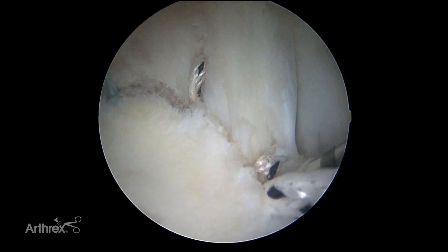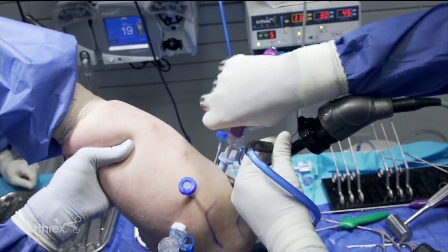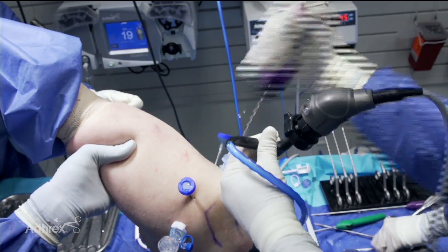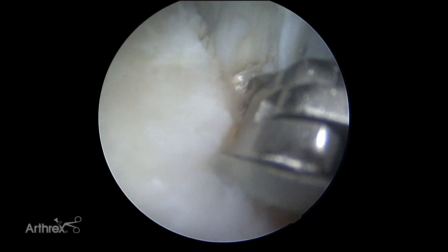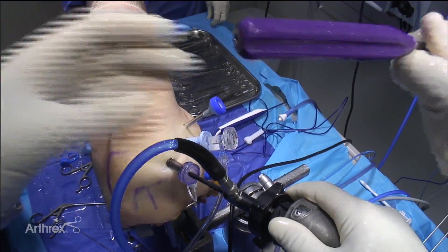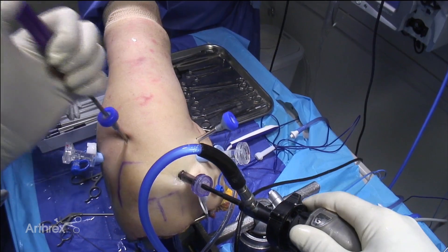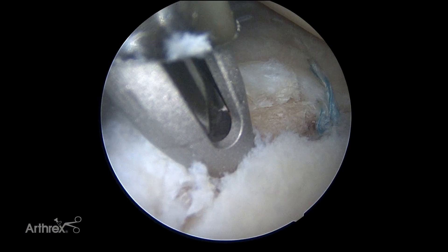If you have trouble seeing, we can come around, and if you can't quite see around it you could switch to a posterior viewing portal. See how nice and robust that repair is. Now we'll go ahead and cut this with the tape cutter — the tip is small enough that it basically fits down a little way into the drilled hole.